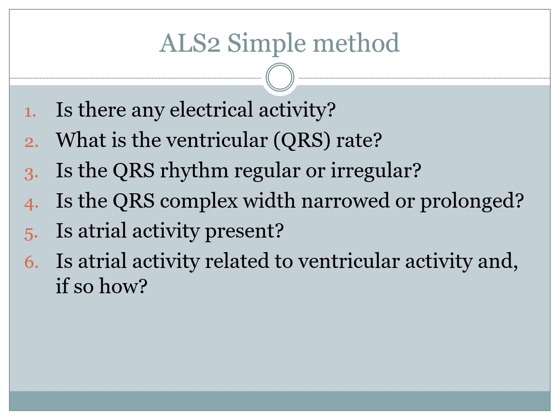Now, this ALS2 simple method put out there essentially looks at problems. So straight away, what is the problem? We're looking at the ventricles, because it's the ventricles first that are going to cause the biggest problem in the output. So first question we ask is there electrical activity? Because if there's not, we need no more question. Why are we looking at anything else? Okay, straight on CPR, that's a system.